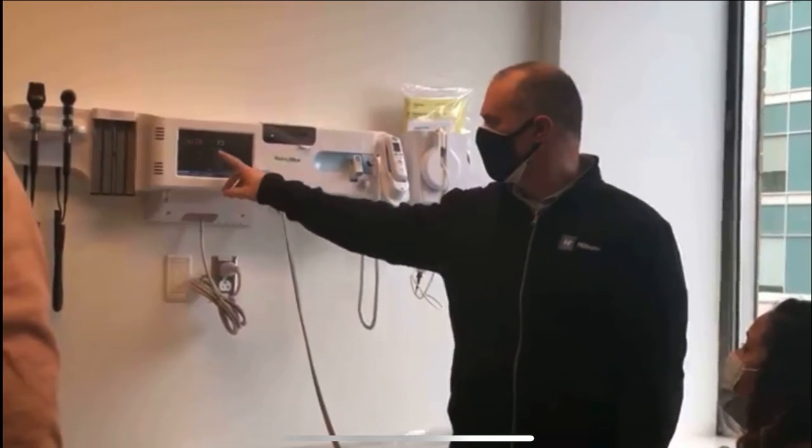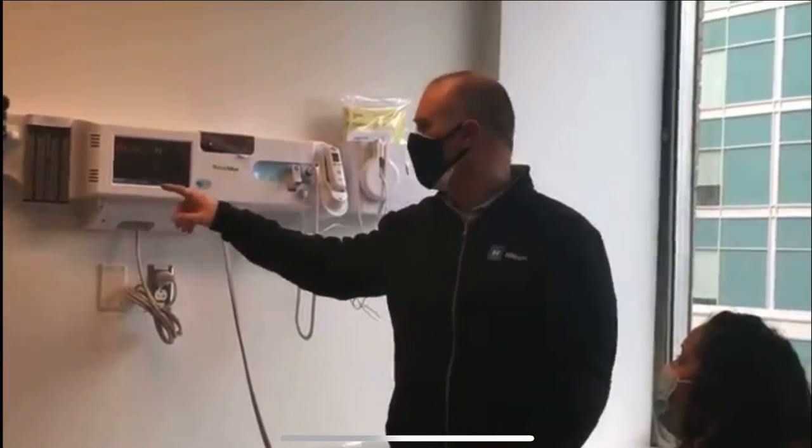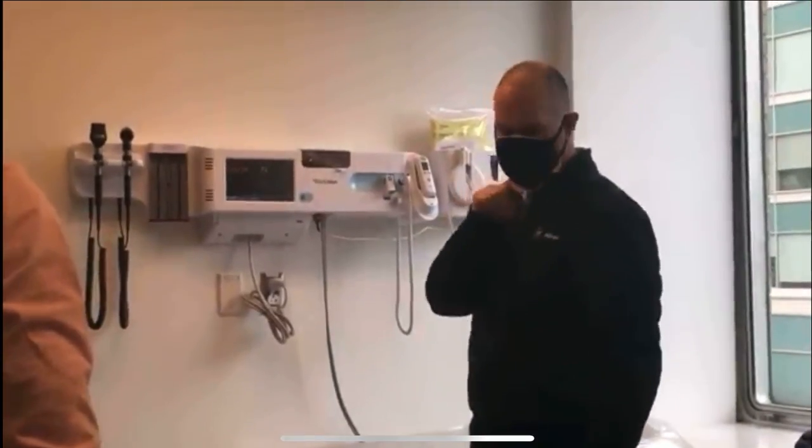You're relatively the same — so that was your second one, which won't count. We're a minute away from doing another one, so it will take some time. I'm going to stop and set you free. Thank you very much.